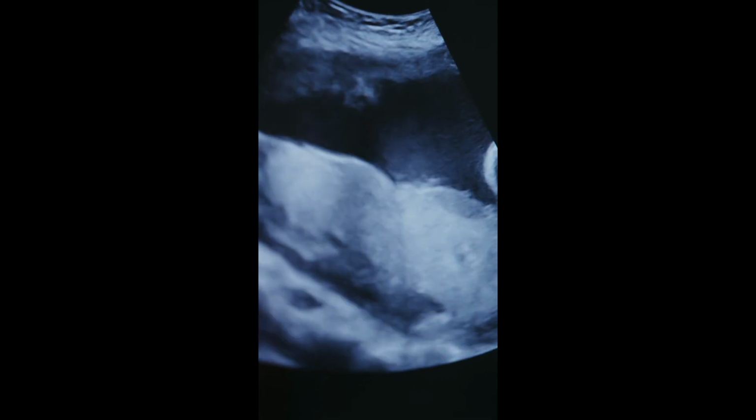Then, gently place the ultrasound probe on the gel-covered skin, adjusting the pressure to maintain good contact without causing any discomfort to the patient. As you move the probe around, the ultrasound machine creates real-time images from the sound waves that bounce off of tissues and organs. These images are in grayscale, where different structures appear differently. For example, hyperechoic structures like bone or calcifications appear bright white, while hypoechoic structures such as solid organs like the liver will appear dark gray. And anechoic structures, like the fluid-filled bladder, will look black.